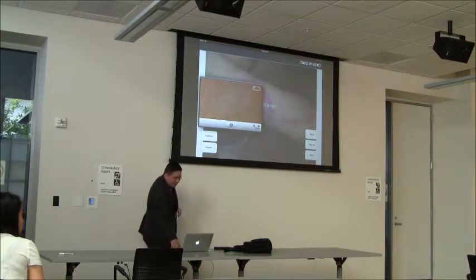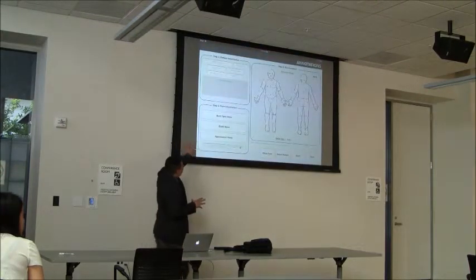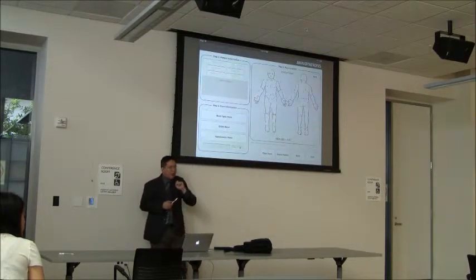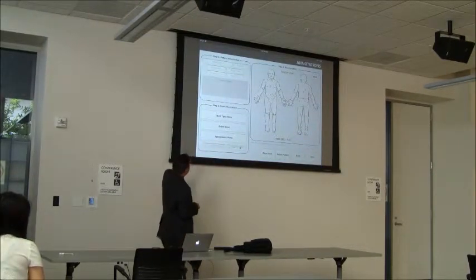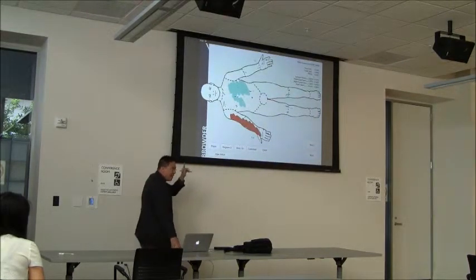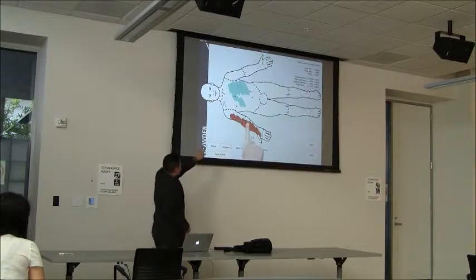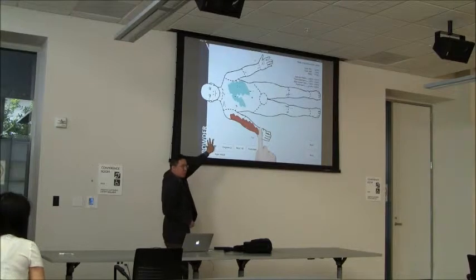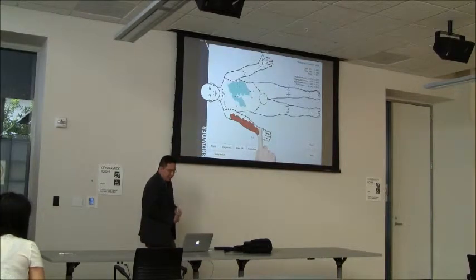Take a burn wound photograph. You can then assign the photograph to a location on the body. So if you want to look at arm photos, you can click the arm and pull up all the arm photos. You can type in all the pertinent patient information if you need to. And then we go to the actual Browder diagram, which looks like that. You finger paint in the actual burns, just like so, and you can differentiate between red for full thickness or 3rd degree burns, or blue for partial thickness burns, which are 2nd degree burns, and it adds it up for you.